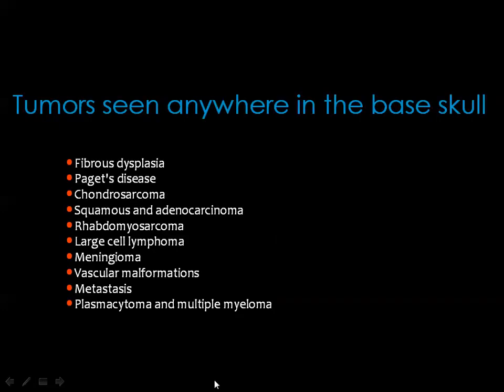These tumors can occur anywhere in the skull base, in the anterior skull base, or the middle or the posterior one.